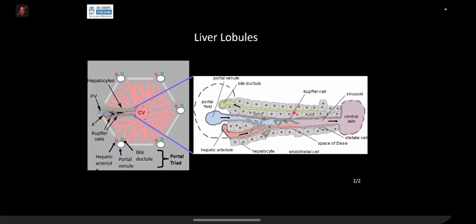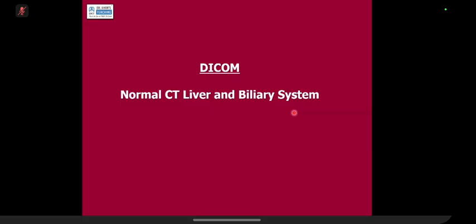And now in imaging, please remember this concept, because this is a key exam concept: we have got imaging where we can image normal hepatocytes. So we have got a particular type of MR scan contrast agent, which has got a particular phase in which normal hepatocytes behave differently and abnormal hepatocytes do not enhance. So if there is a tumor, it will not have hepatocytes. And keeping this, we can diagnose so many things. And for you, that is critical to learn. CT, liver and biliary system.